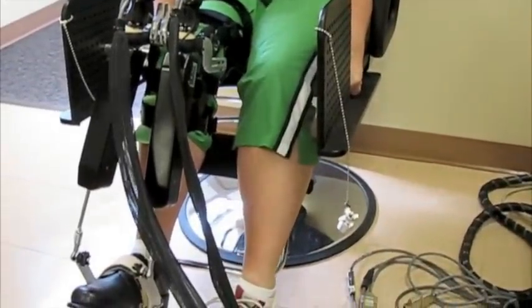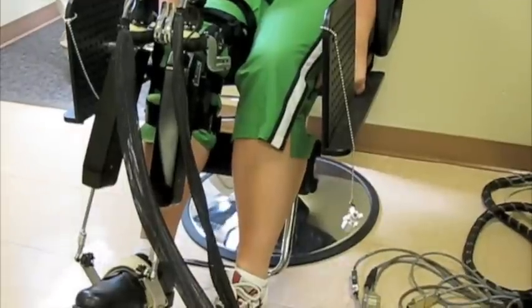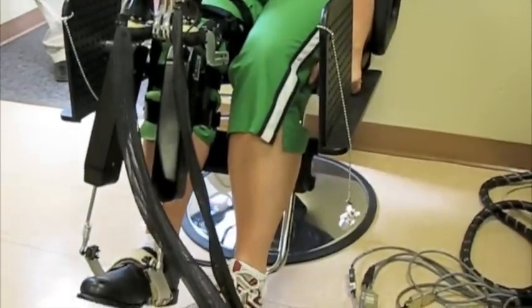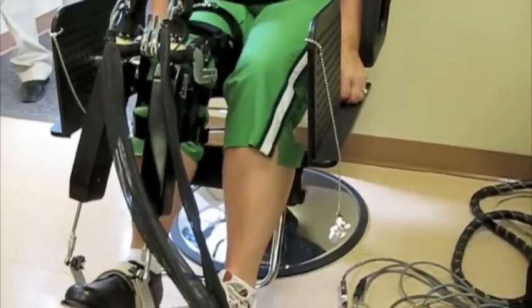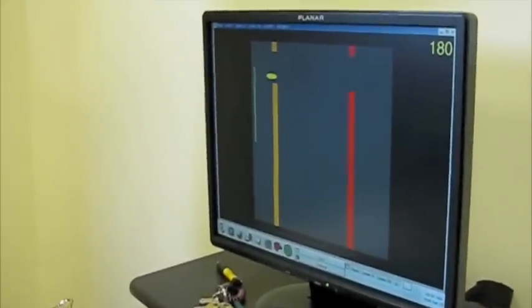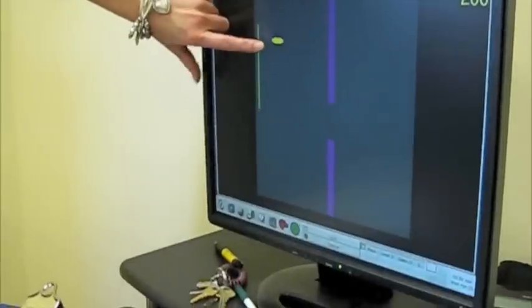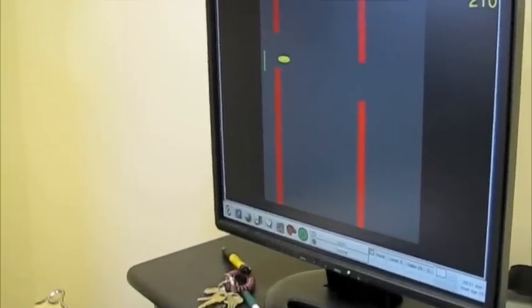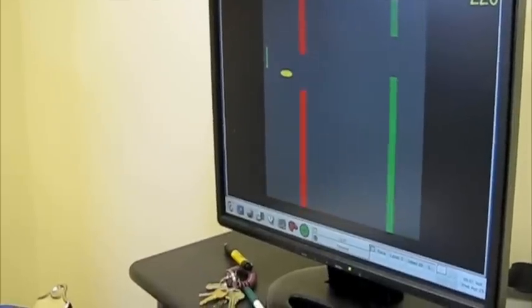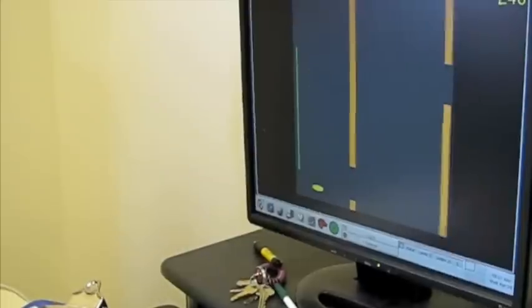She's going to do approximately 200 movements in this position. So essentially her foot is the mouse for this game? Correct, and it's controlling this cursor. As she improves, we're going to increase the speed and decrease the amount of help that the ankle robot is giving her.